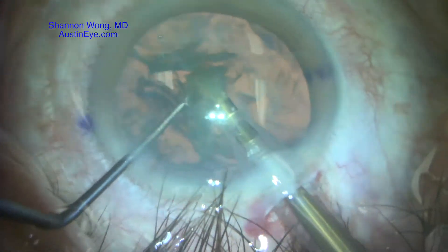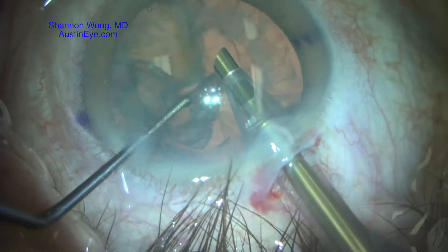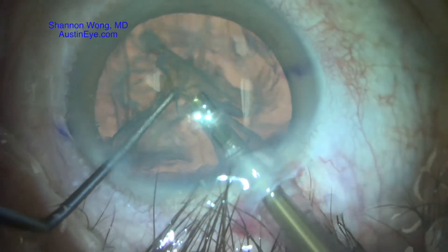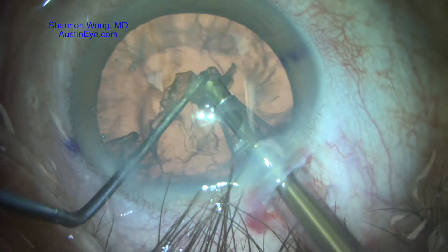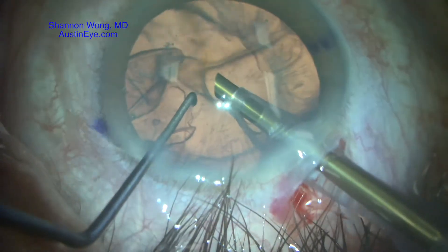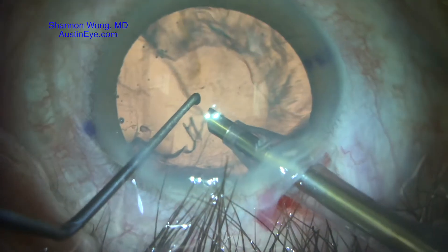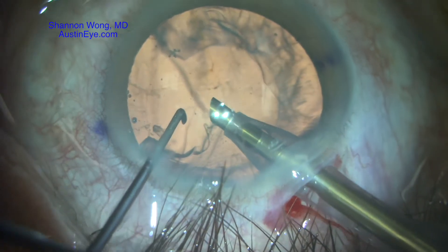Phacoemulsification and irrigation and aspiration of the cataract is performed in a routine manner. We then get a better look at the anterior capsule extension that we can see at 7 o'clock.